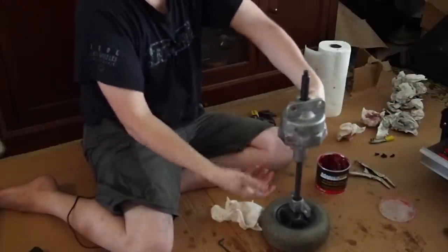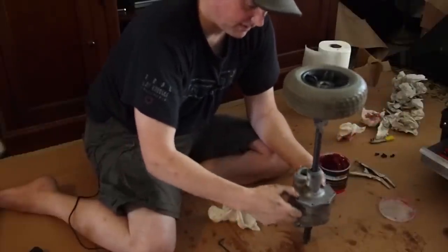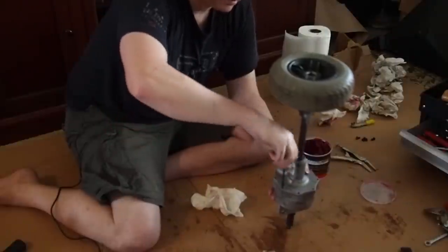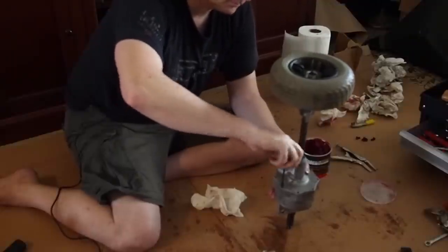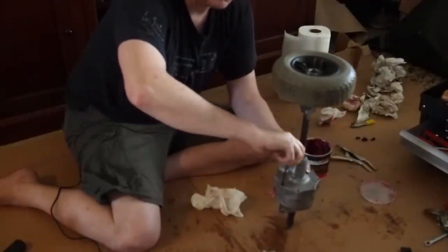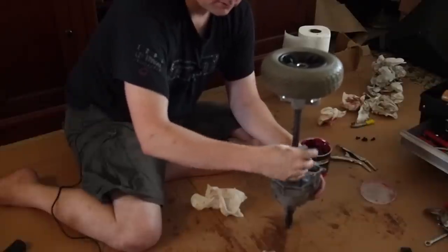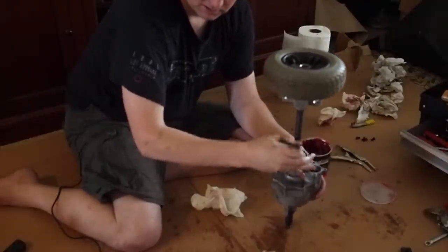Now the bolts are on the other side, so I flipped the whole thing over. Almost lost it. There's a little alignment plug there. Push that down. And I could start screwing this thing back together. Like I said, it'll go together pretty easily. Getting the whole scooter together is kind of just in the reverse order of what I took it apart in. So when I put this together with these two screws, I'm just going to check to see if it still turns and still okay. And if it is, then we'll do the rest.